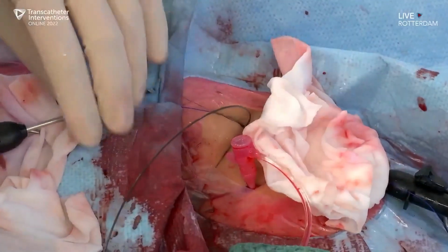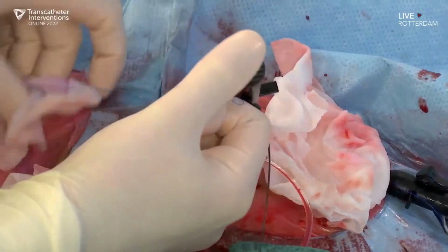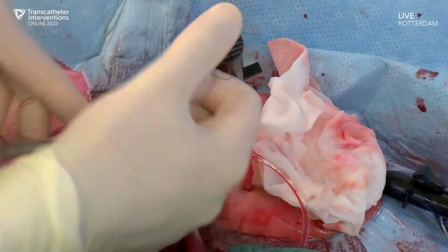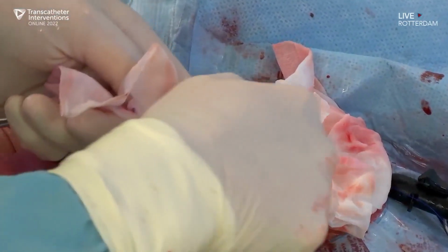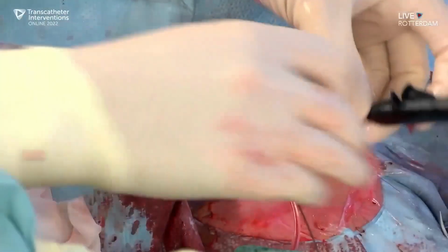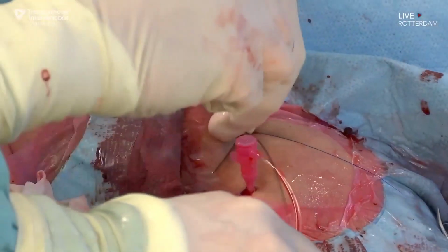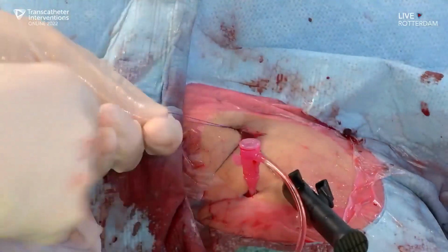And Didier, we know that that is somewhat exceptional with 2 sutures. Oftentimes you need an additional closure. We've learned that from the MESH trial. But I think Herrier can pull the wire, and then we'll make a final angio through that 4 French sheath that we have in the superficial artery. And I really like this safety.